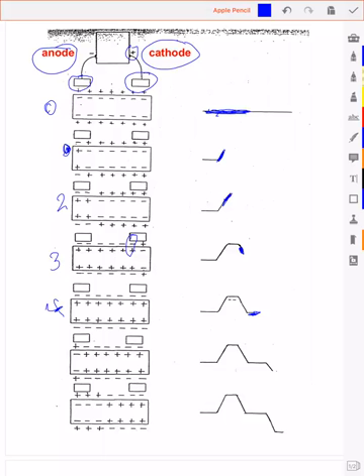So remember, your ECG doesn't really tell you about the state of the cell. It only tells you about the state of the outside of the cell at one electrode relative to the other. And if both electrodes are seeing the same thing, then you're going to get a baseline recording here. And that could mean all the cells in the heart are depolarized, or it could mean that they're all at rest. But if it's all the same, the electrodes are going to see the same thing, and you'll be at baseline, okay?